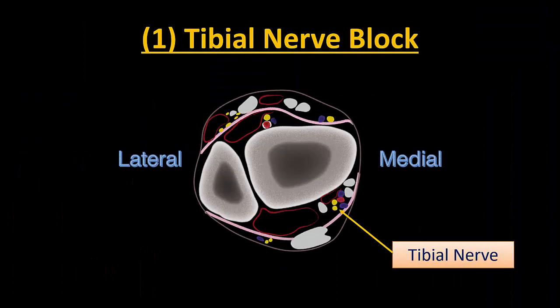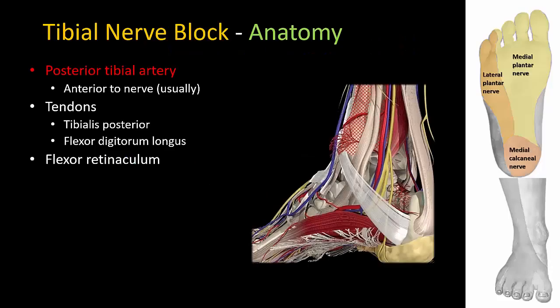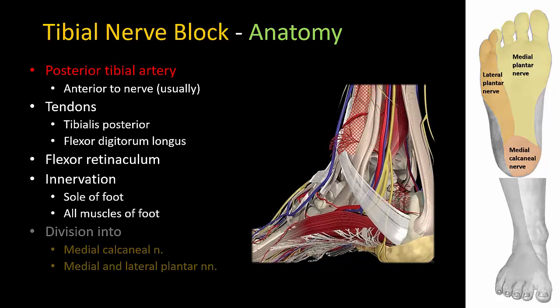I usually start with the tibial nerve block as it is the most important of the five nerves. The chief landmark is the posterior tibial artery, which usually lies anterior or medial to the nerve. Further anteriorly you may see the tendons of the tibialis posterior and flexor digitorum longus, which should not be mistaken for the nerve. Overlying these structures is the flexor retinaculum which has to be penetrated to reach the nerve. The tibial nerve innervates almost the entire sole of the foot and the majority of deep tissues.